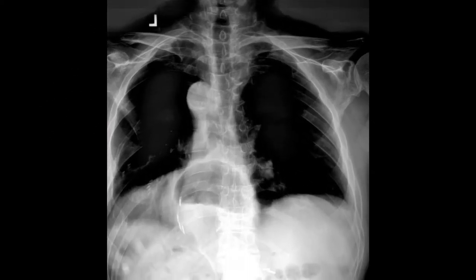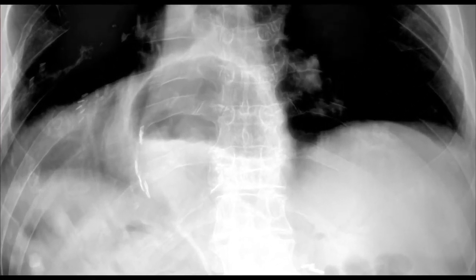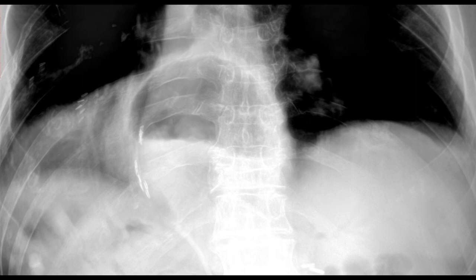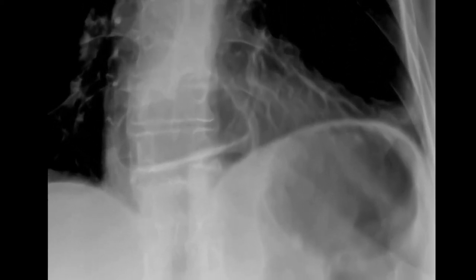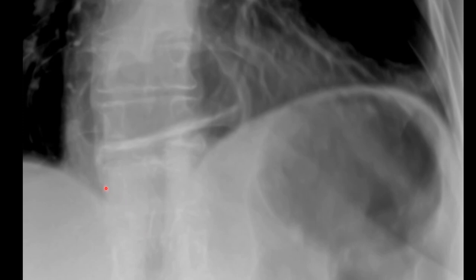This is another example of a hiatal hernia — note the position of the gastric air bubble. Hiatal hernias tend to be midline, so if there's not a clearly visible gastric air bubble under the left hemidiaphragm, look midline. On this frontal thoracic view you'll observe a large gastric air bubble, but then there's also an additional air bubble midline. This area right here represents the hiatal hernia.